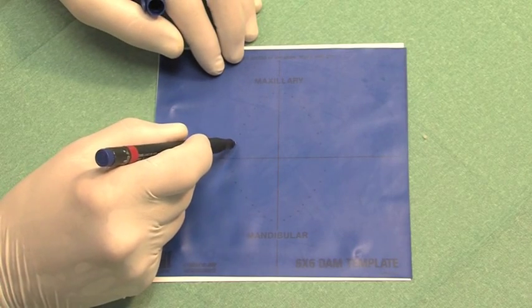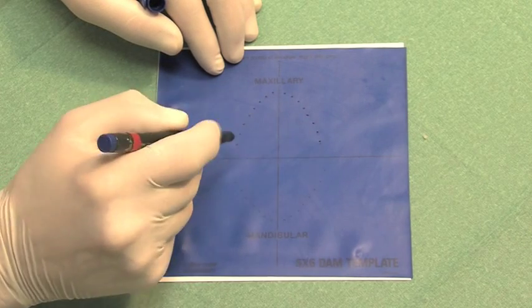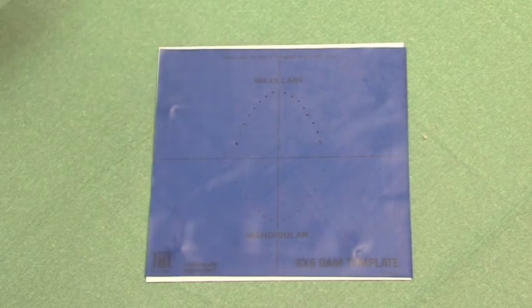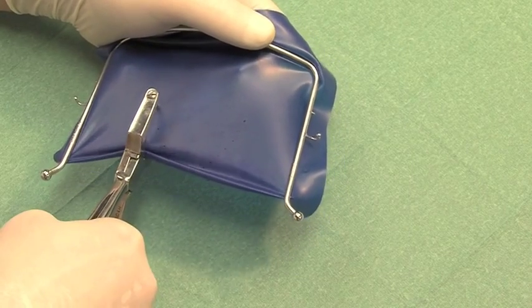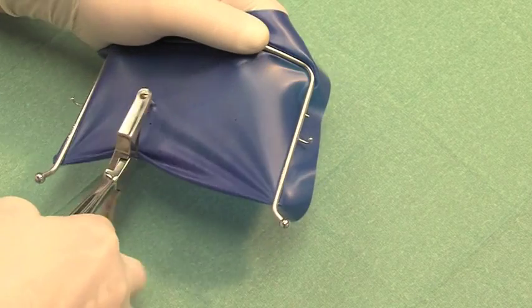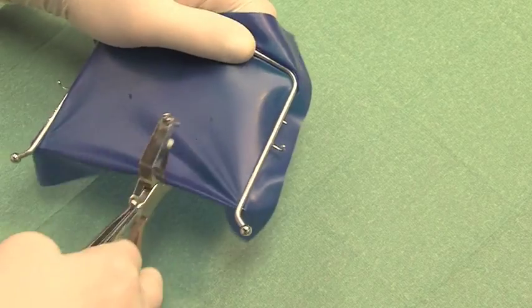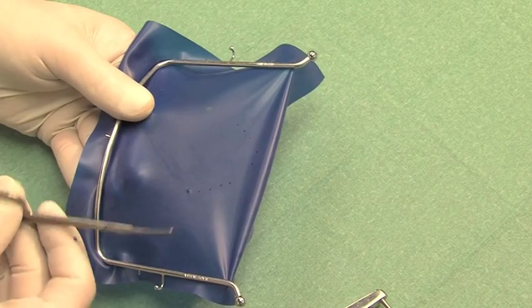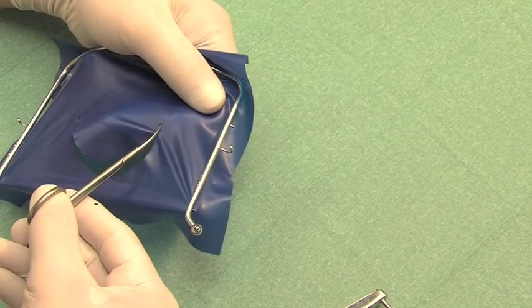Using the rubber dam in the traditional manner, the hole positions are marked using a template. The rubber dam is then stretched over the frame and punched. The dental arch can also be cut out to give a better gingival overview.